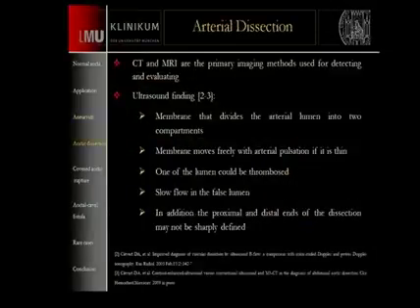If we think about arterial dissection, often we find in the grayscale the movement of the membrane. Sometimes the question is whether both lumens still have a flow inside, yes or no. And what about the perfusion of the kidney? You have to look really carefully at the kidney, because most of the time either the right or the left side of the dissection will enter from the false lumen.